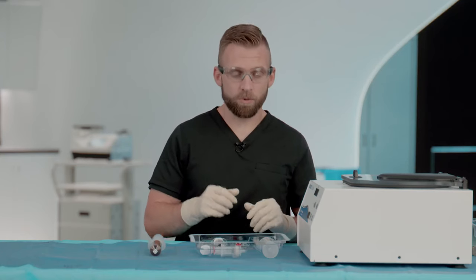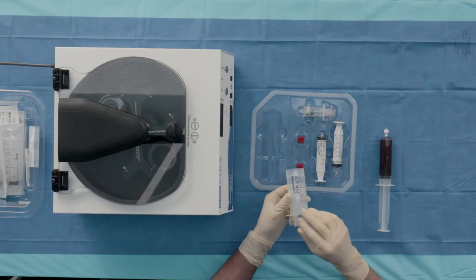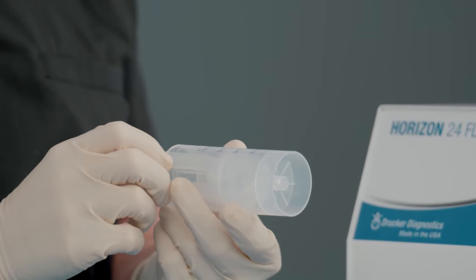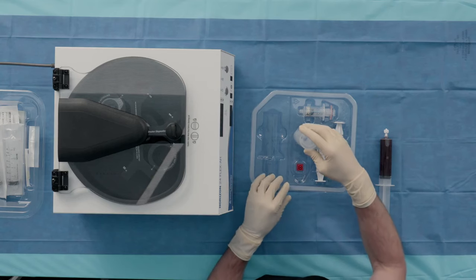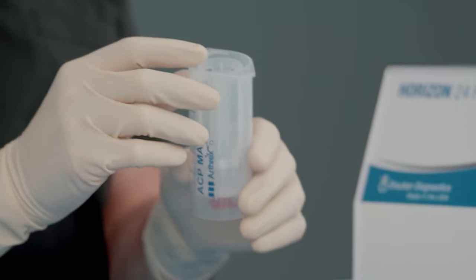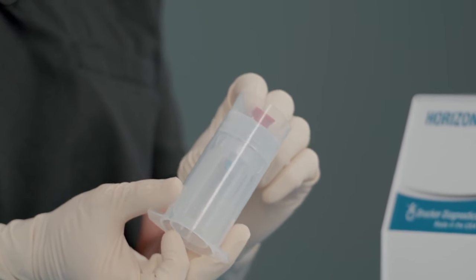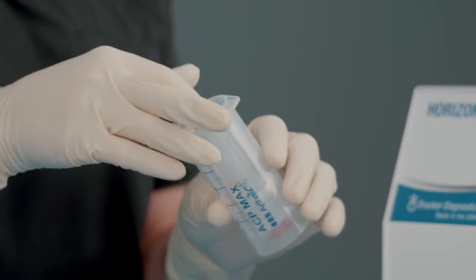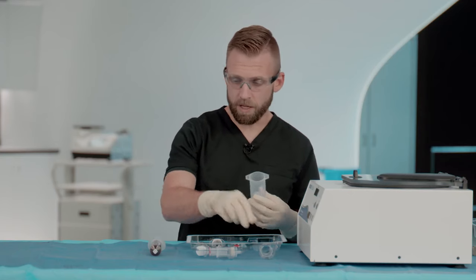With the blood draw completed, we'll remove the ACP Max syringe from the tray. We'll prime the syringe by expressing air out of the system, and then cap the syringe with the red cap in the tray. The blood can be introduced from the top of the valve or the bottom using a female-to-female connector. We'll remove the syringe guide and then slowly begin filling the ACP Max system with our blood.